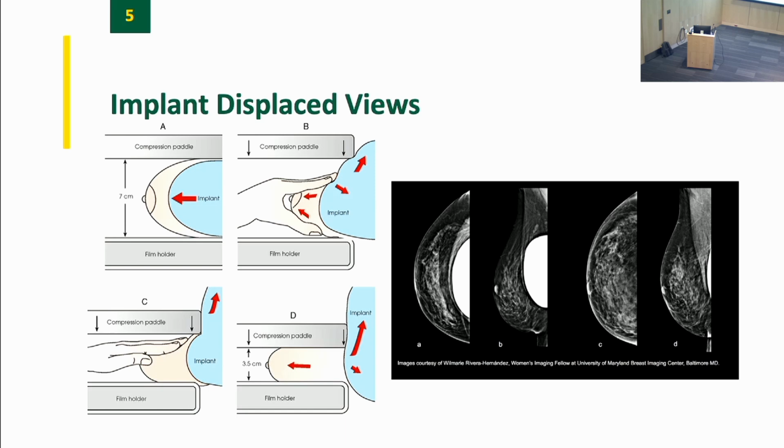Think about the chest tube example. Shortcuts. Be more specific. You can't just say shortcuts and bias anymore. It's an artifact. Okay. Right. So it's a big artifact. And remember our conversation about random versus non-random? That was about missing data, but let's talk about random versus non-random artifact. So are implants, based on what I said 30 seconds ago, present at random, or are they present in some distribution of women?